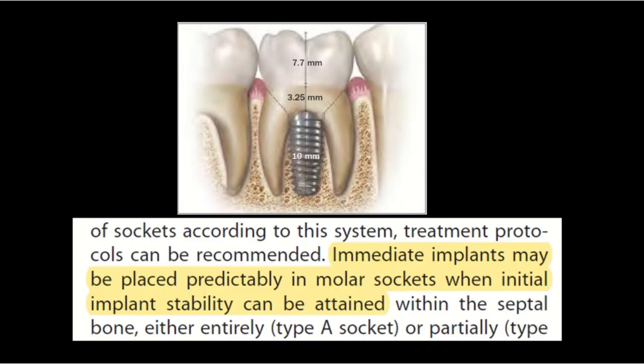Also, in some conditions, especially in extracted sockets, you may perform your osteotomy bed in one place and then insert the implant in another place. Usually, this new location is not prosthetically driven and not satisfying for you. Please remember this condition. Again, fully guided surgery usually ensures both primary stability and, at the same time, no slippage and the implant installation in the prosthetically planned position.